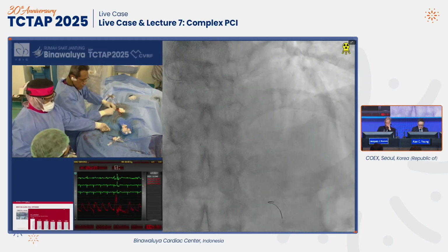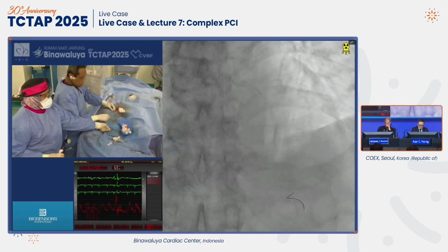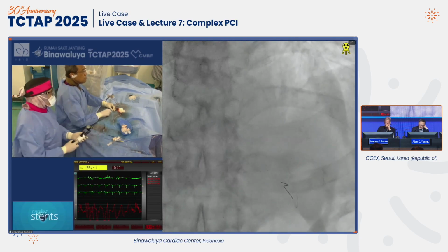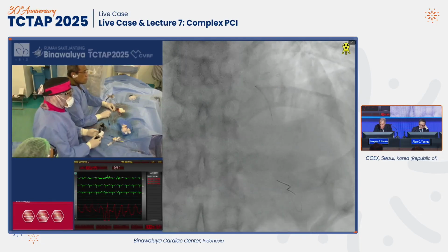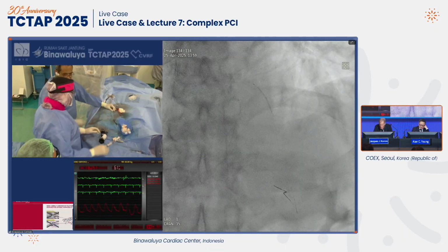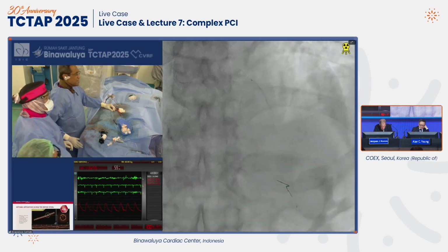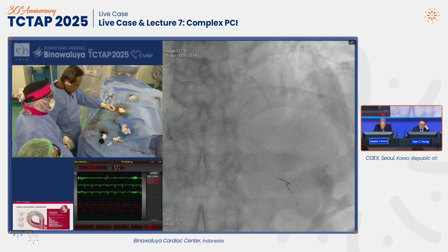3.5 first. I think it's important that, obviously, when you do 2 stents, you do not end up covering the diagonal ostium with 2 layers of stent. That would not be a good thing. So sometimes it's easier to do the proximal first, so that you are for sure short of the diagonal and then overlap with it.